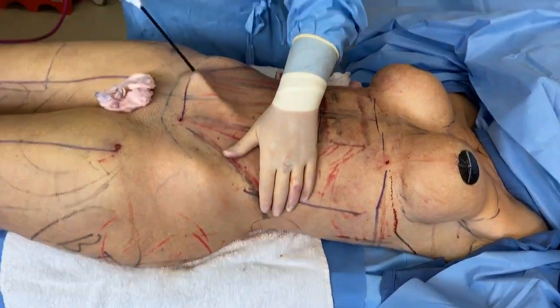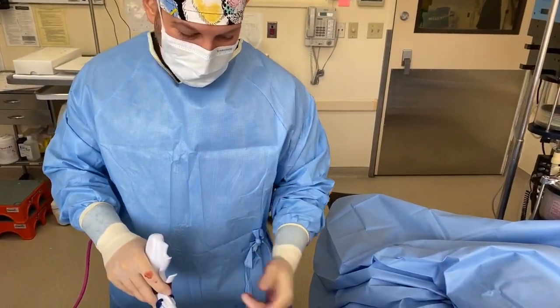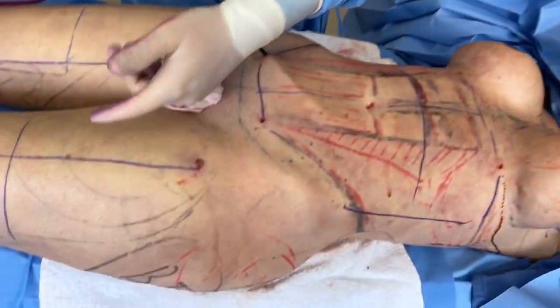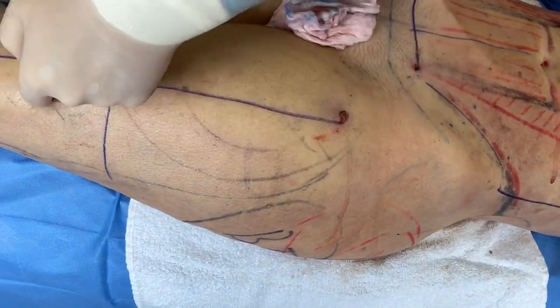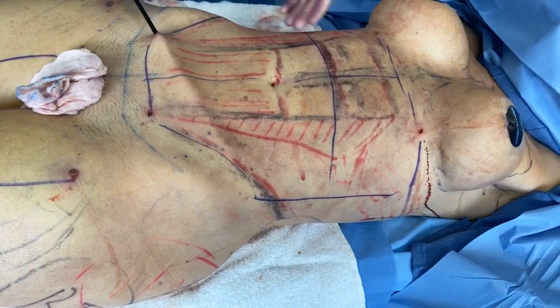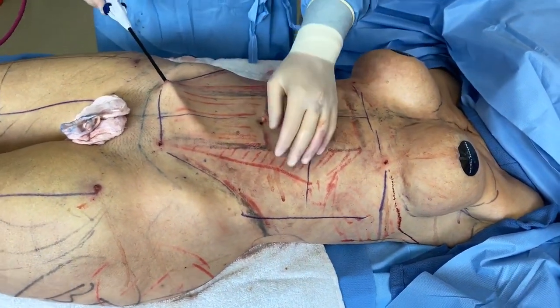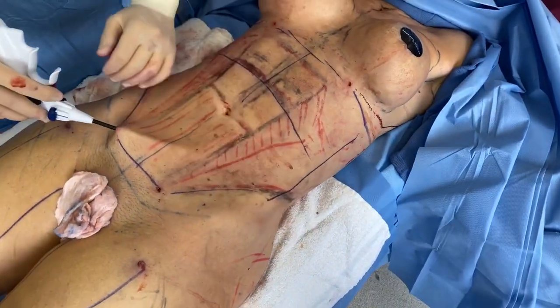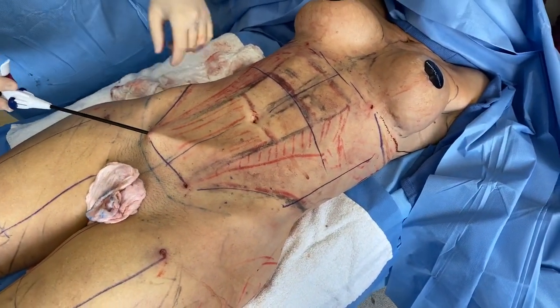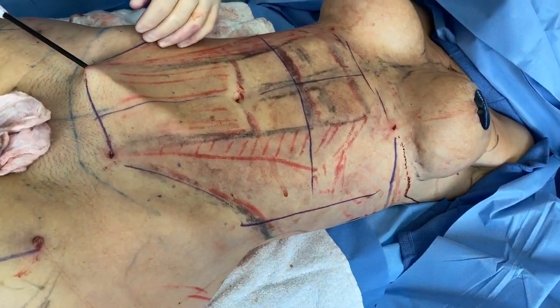I was the second doctor to use this in the United States, numerous years ago. We've done thousands of treatment areas. Even on the legs, we do one, two, three, four, five, six per side — twelve treatment areas — and we're doing a number of them here as well. The settings are based on experience and the result you're trying to achieve.